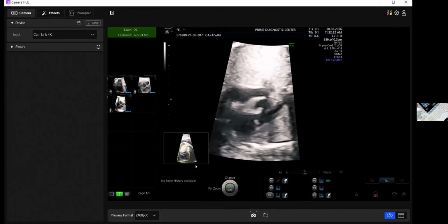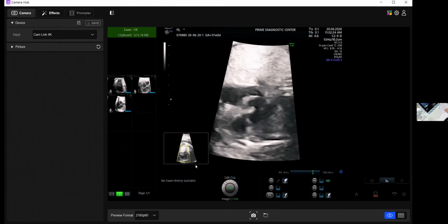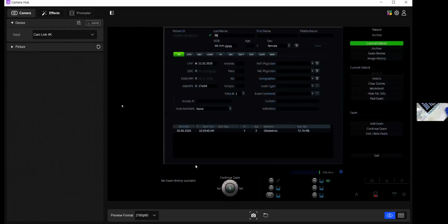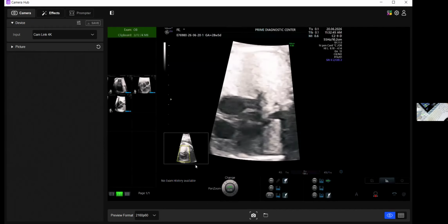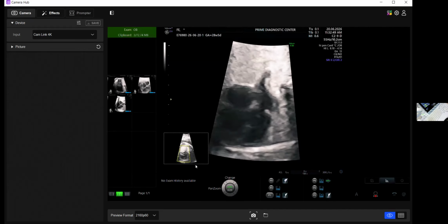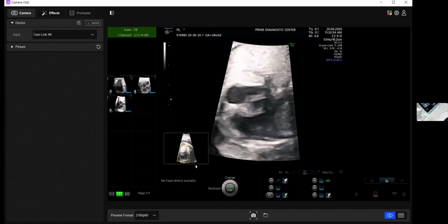Okay, so we have not entered the name. Can we enter the name right now and the gestation age so that we can do the Z-score? Fine. So we have to have a gestational age fed in there. I'm not as smart as you guys are to take FL and circumference to calculate.